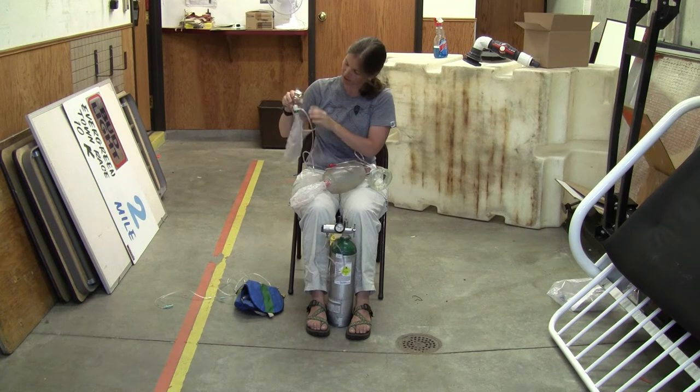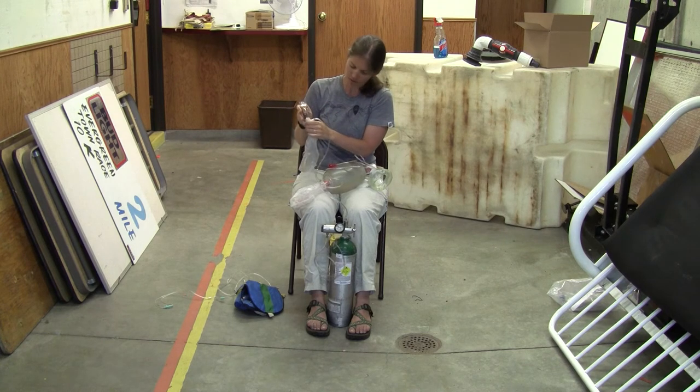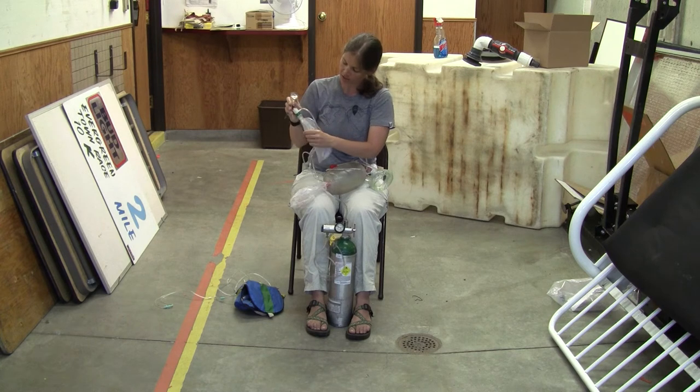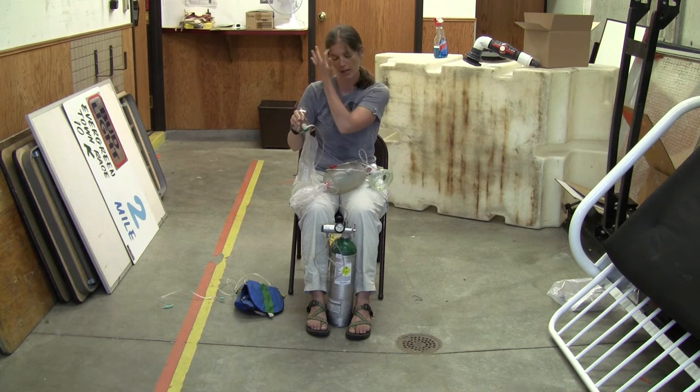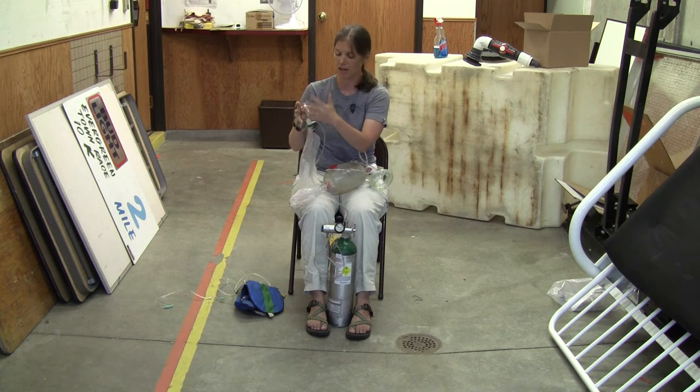Before you apply the mask, this reservoir bag needs to be filled. By pressing down on the flaps once the oxygen is flowing through the mask, you should see the reservoir bag inflate. It's very important that it is inflated before you apply the mask to the patient, because then they are pulling oxygen from the reservoir bag instead of from the ambient air.